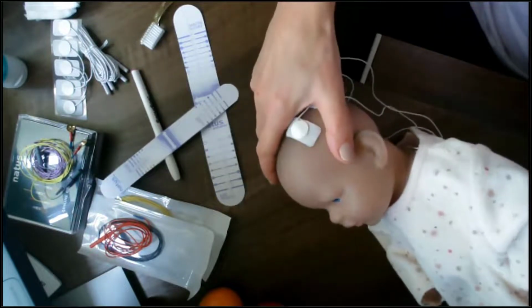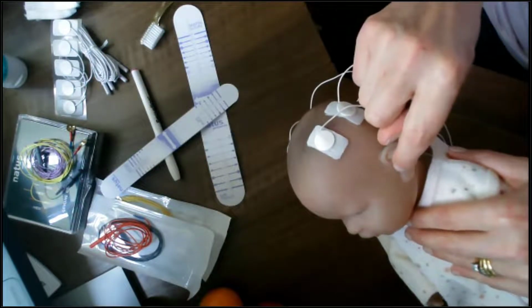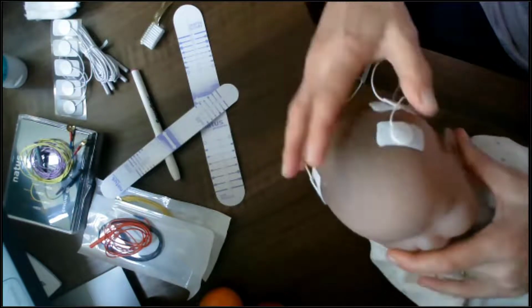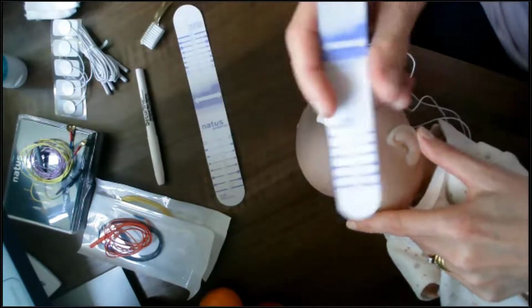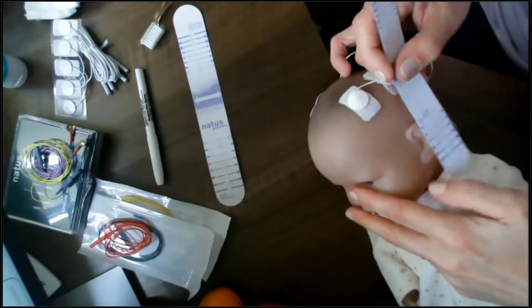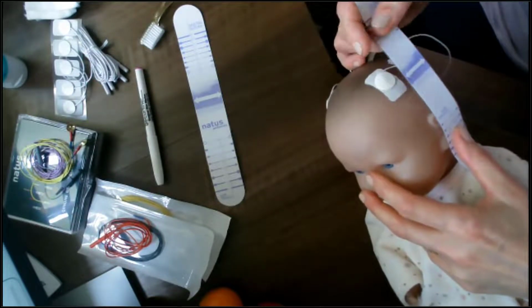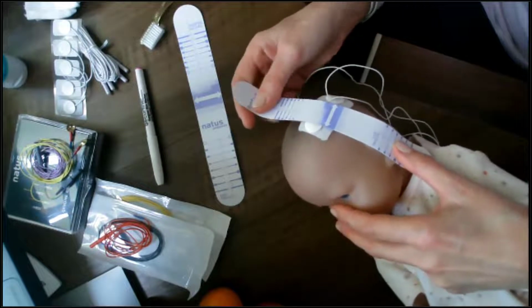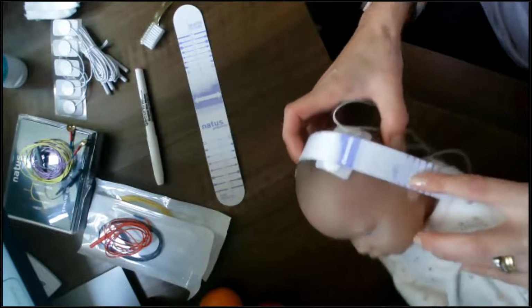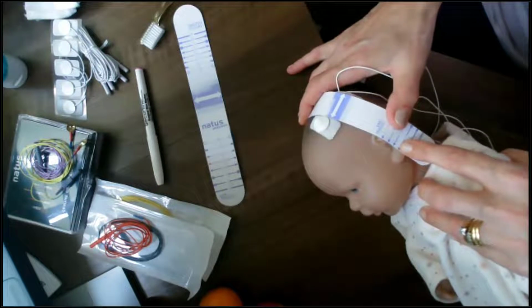So I'm going to do one side at a time. Again, remember, we're going to locate our landmarks, the ear tragus and the sagittal suture down the middle of the baby's head. So I'm going to take my positioning aid, and the bit that says ear tragus, I'm going to put parallel and directly align there. And then I'm going to bring the positioning aid up and over the top of the baby's head. Okay, so you can see that my ear tragus is there. I've got this running up and over the top of the baby's head.